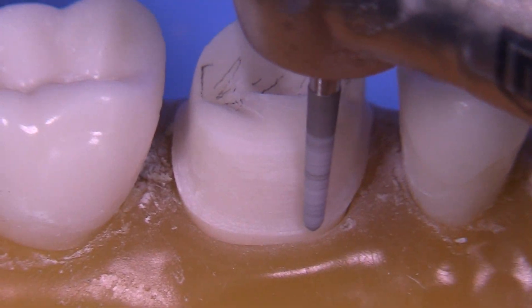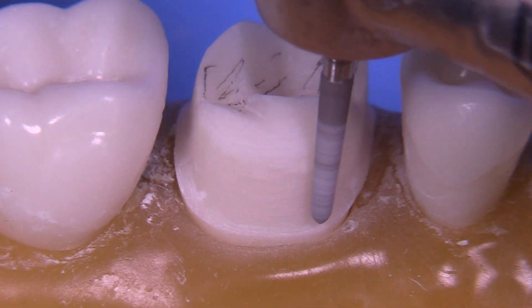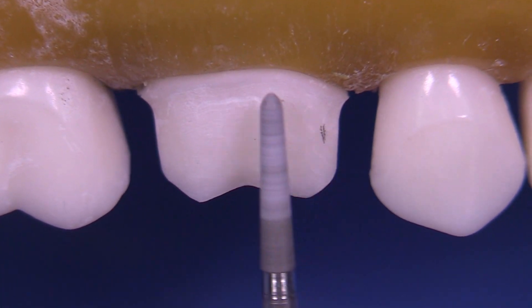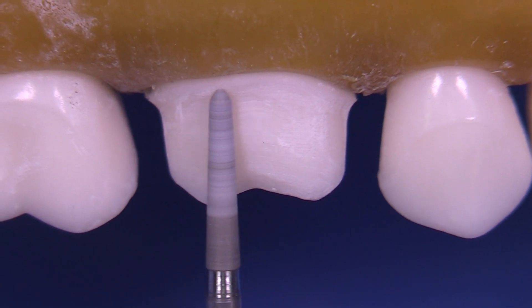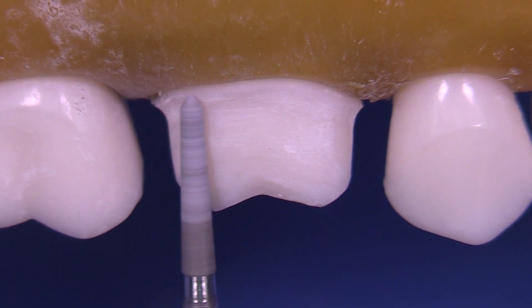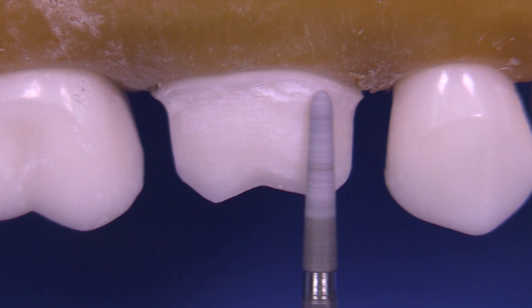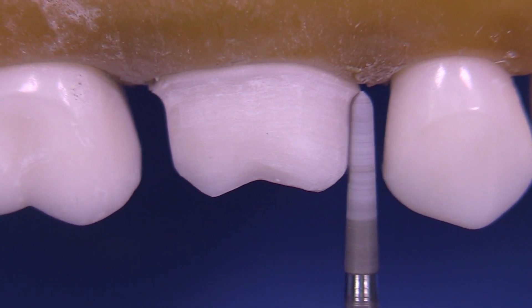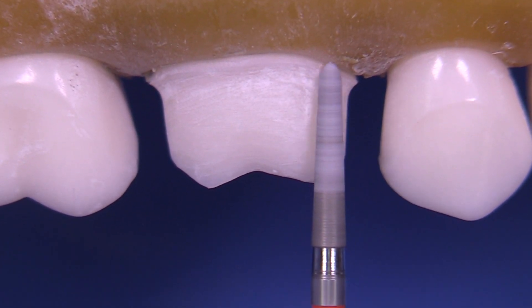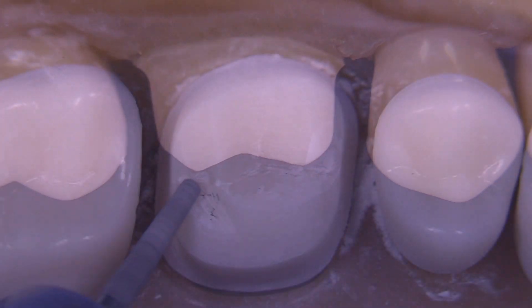I'm not using the handpiece at full speed. We're using the handpiece right now with partial foot pedal depression. This is a stall-out sort of approach, and the stroke I'm using would be called a brush stroke — the bur is not laying on the tooth continuously. It's intermittently removing itself from the surface so we can have a little bit better control of the final outcome.